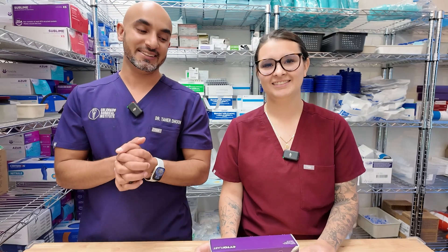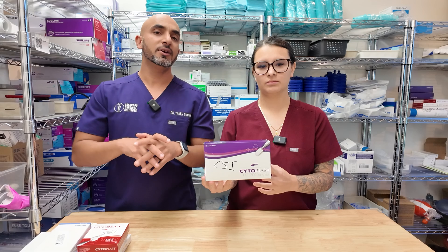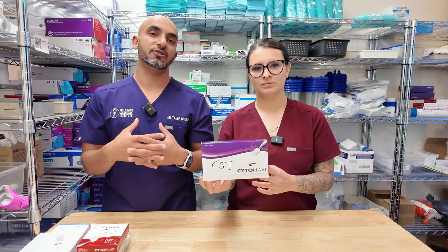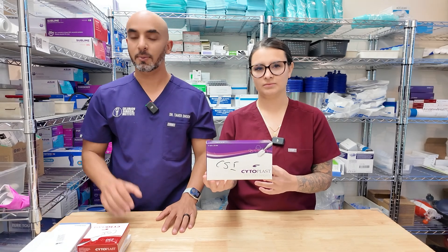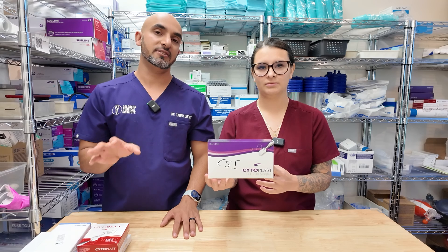We're going to talk about membranes. Right here we have the Cytoplast membrane, which we get from Osteogenics. You can get Cytoplasts from a whole lot of different places, so just make sure that you get a product that you're comfortable with. Osteogenics is pretty reputable, but Maxius and some of our other partners are also super reputable with amazing products.